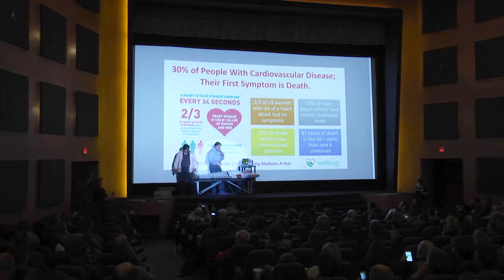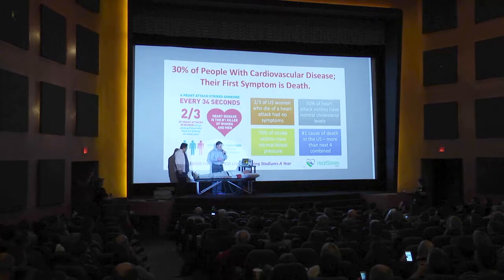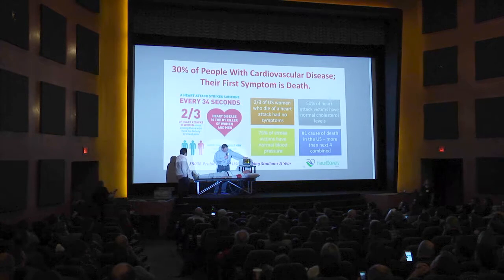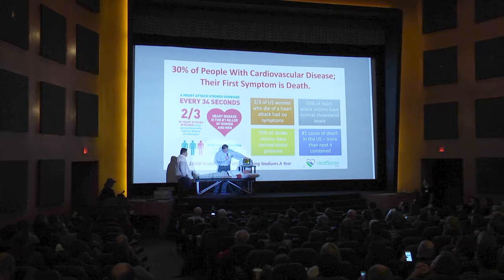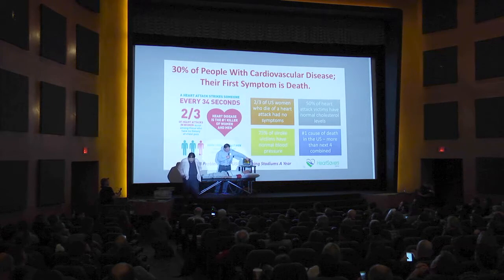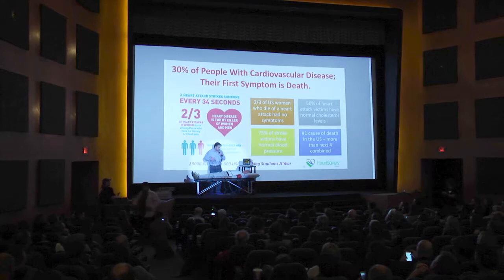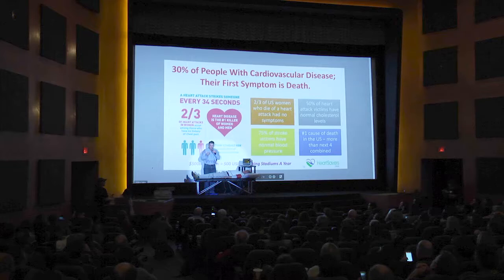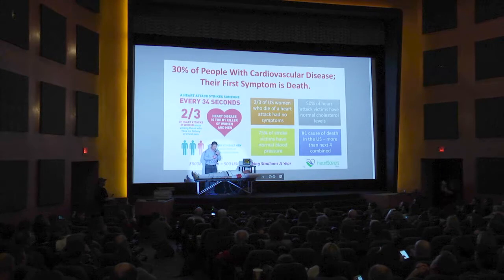Okay, so I attached a sensor to Mike's wrist here, and we take blood pressures while we do this. And most of you can see we got a waveform here, really nice waveform. We got a dichrotic notch prominent right there. So what we're going to do is we're going to go ahead and take this test. And what this is doing is going to collect information on 6,000 data points. And we're going to figure out the measurement of his elasticity of his arteries.